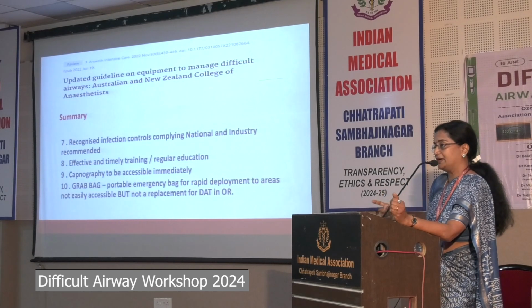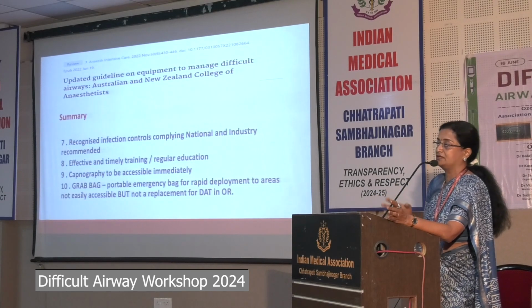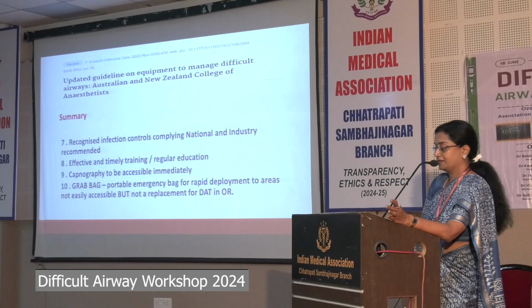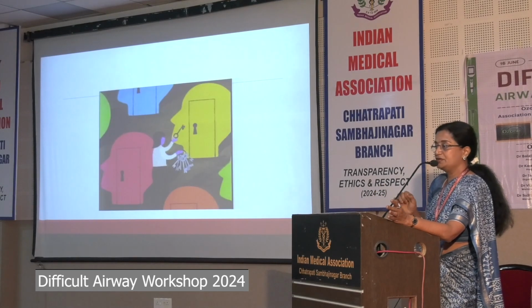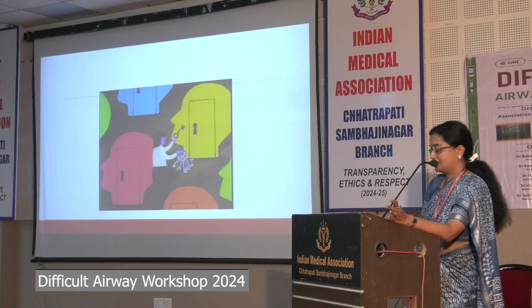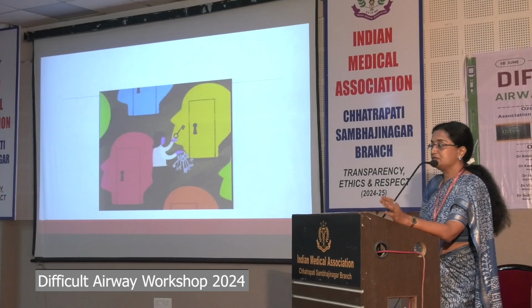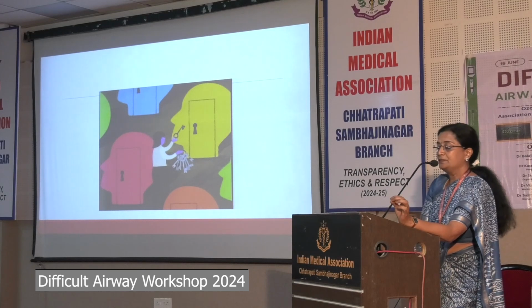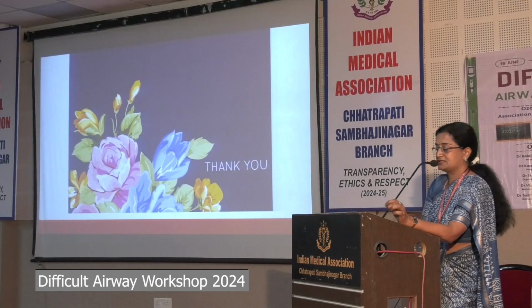The grab bag is for the freelancers. The portable emergency bag for rapid deployment to areas not easily accessible should be present, but it is not a replacement for the difficult airway cart in the OR. You have to see which key fits the lock and keep your equipment accordingly. You may not have all the equipment, but what you have should be properly in place and easily accessible.